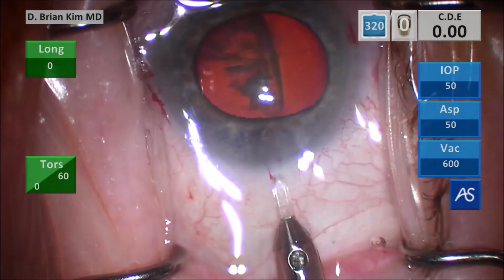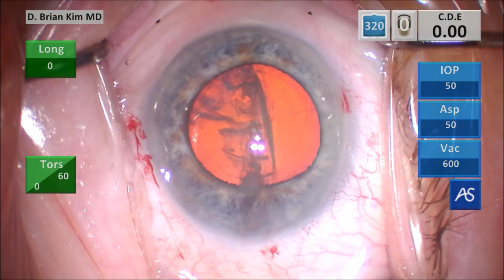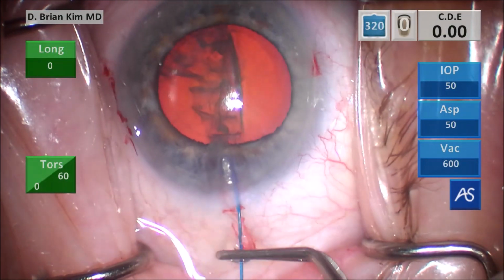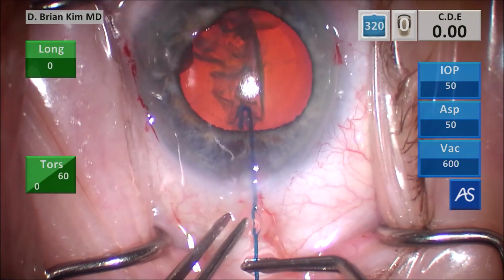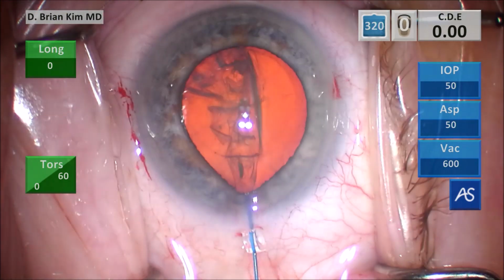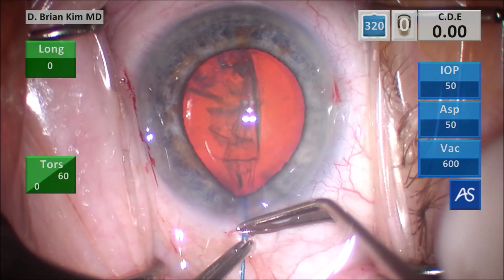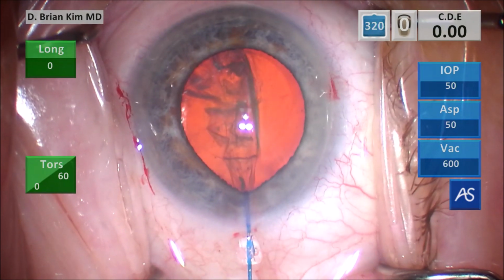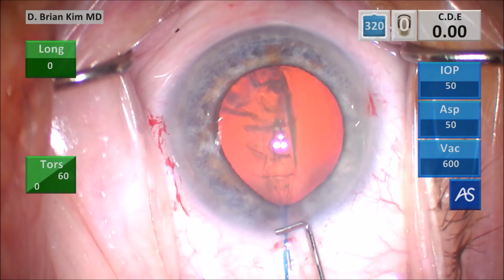So this is the technique. I'm using my diamond blade to create a single episcleral stab incision subincisionally, going through the conjunctiva and then the sclera. And then I'm going to place this iris hook with the forceps, making sure I get around the iris but not around the rhexis. And so it's perfectly around the iris, not involving the rhexis. I'm loosening it up just a little bit here. But you can see I have a really nice and retracted iris now. That will not prolapse any further now that I've placed that hook there.